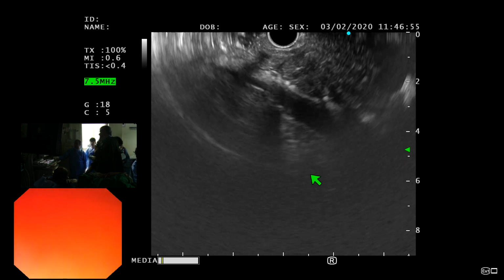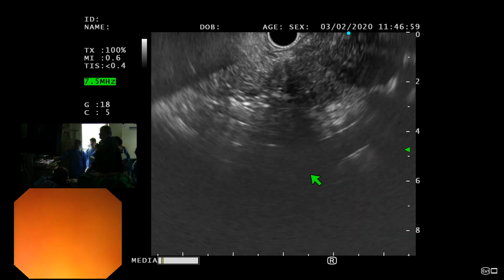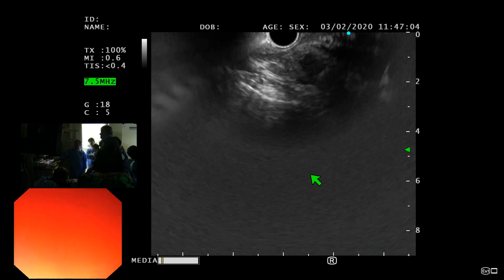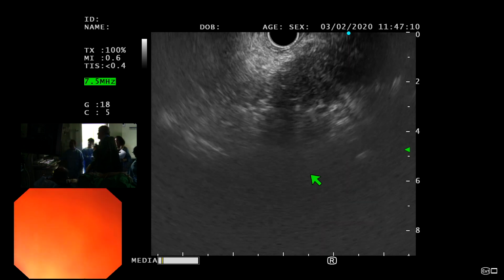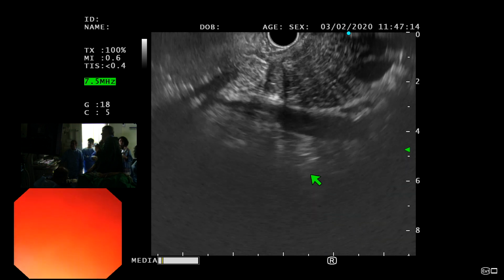Okay. Bile duct with the stent in. Have a glimpse of pancreatic. I don't think pancreatic duct here is really that nicely visible, but we saw a glimpse of it. It's certainly not dilated. So that's the superior mesenteric vessels coming there, just there.